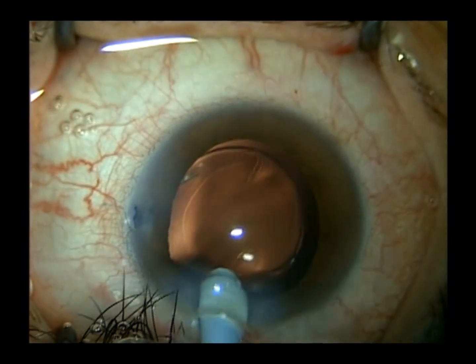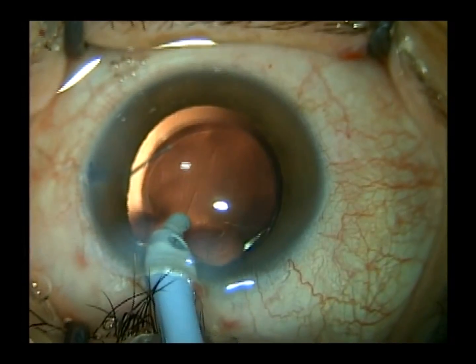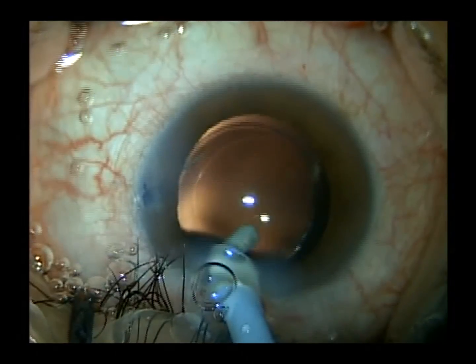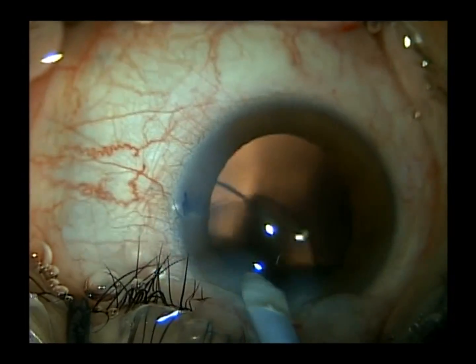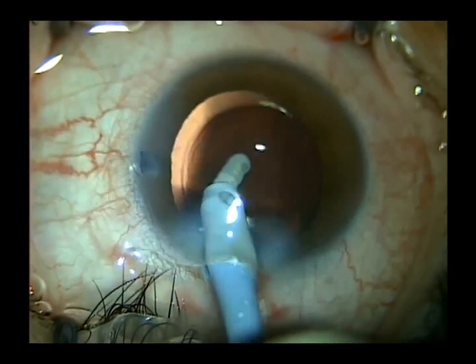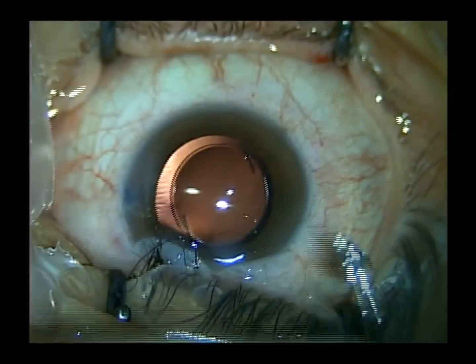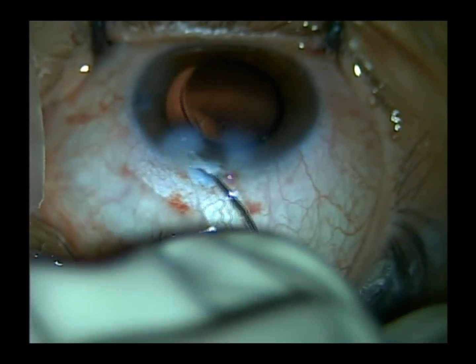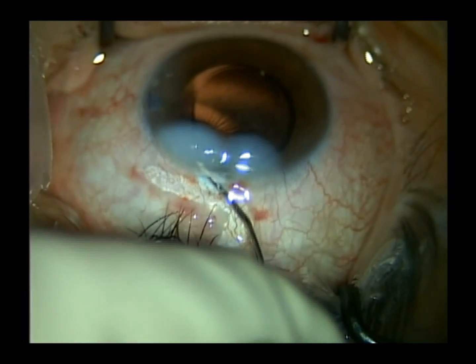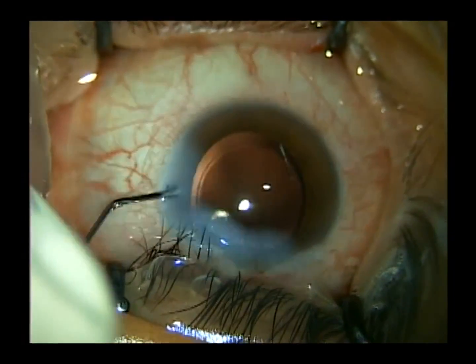At the end of the case we've got a beautifully centered lens implant, surrounded 360 degrees by the anterior capsule leaflets. We remove any residual cortical fragments using silicone tip irrigation and aspiration, and then we stromohydrate the incision. At the end of the case the lens implant is beautifully centered.